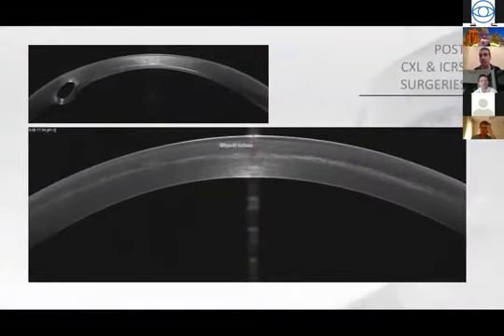Now, again, if you're a refractive surgeon and a true refractive surgeon, you're not going to let yourself just do DALK for keratoconic patients. You're going to try everything before you get to DALK. So you're going to be putting corneal ring segments, do cross-linking, do topography or corneal wavefront guided, and even phakic IOLs, and probably everything one colleague calls the quadruple procedure. I mean, you can do some, all, whatever, but you definitely have to treat keratoconus as a refractive discipline, more than just pure hardcore cornea.